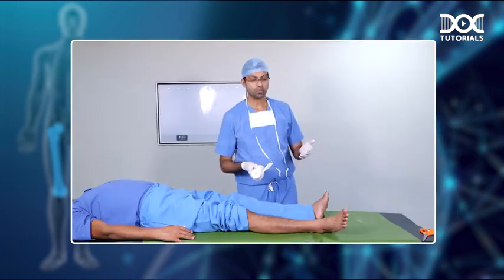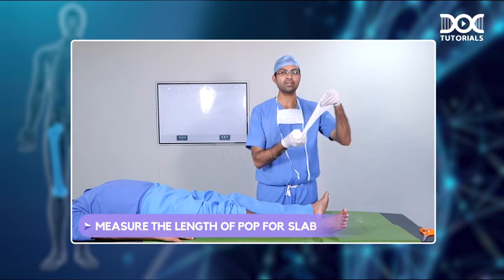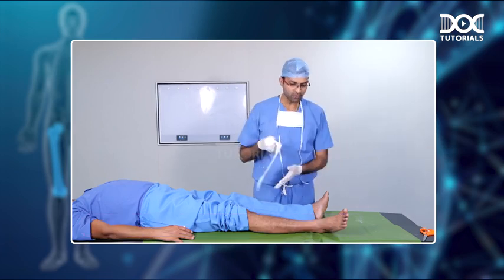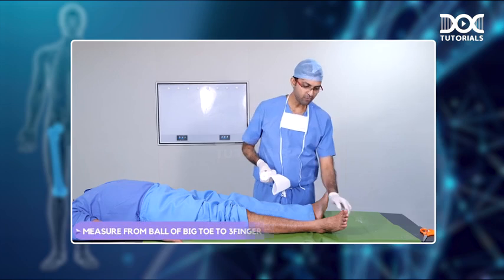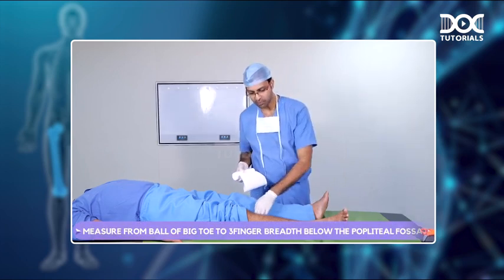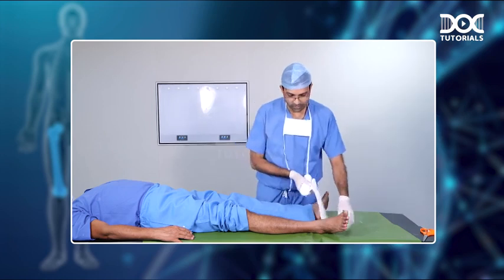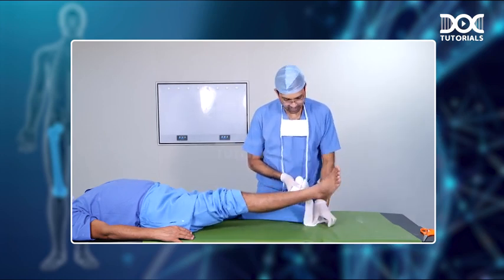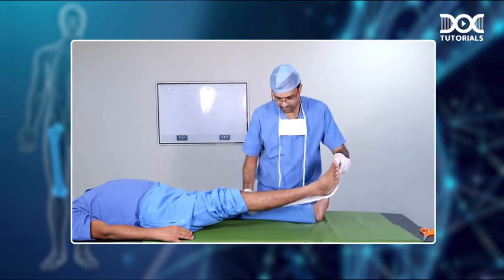Next thing to do is to measure the length of the POP that we need to make the slab. Generally for below knee slab, we measure from the ball of the big toe till around 3 finger breadths below the popliteal fossa. Then you can ask the patient to lift the leg a little bit. Then you can measure out the POP like this.